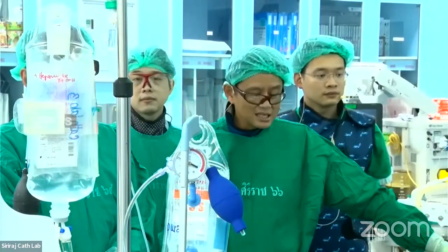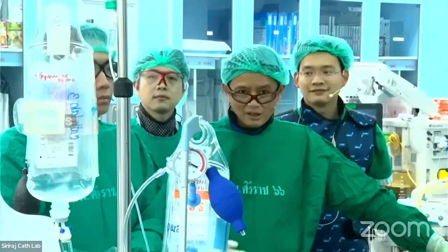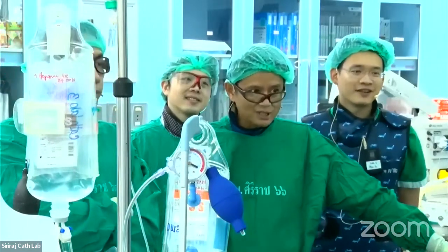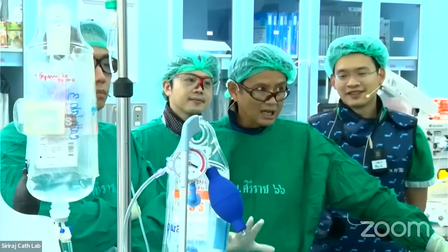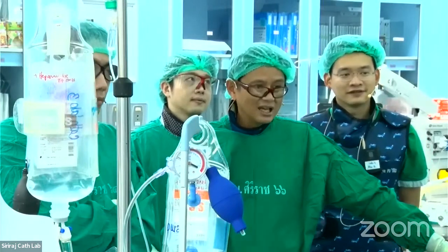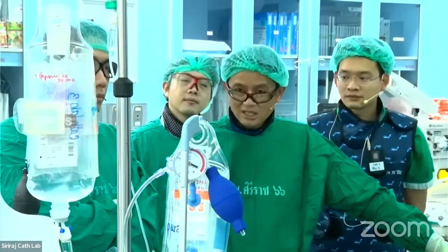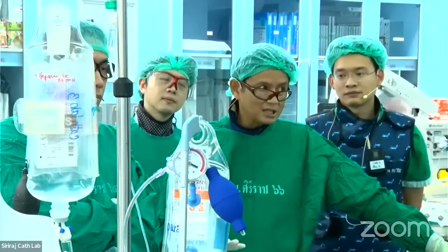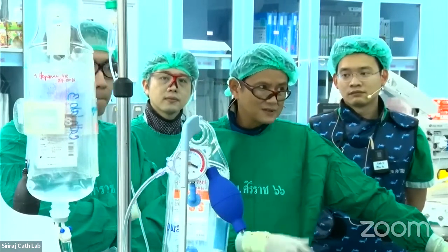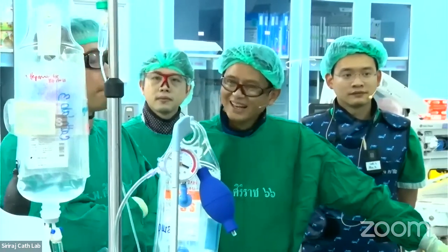And then decision, kiss, not kiss, I think it could be routinely, I kiss all the time. But on this case, if I kiss and I dissect, I may end up with two stents, which I didn't plan at the beginning. So I'm leaving the kissing balloon at the ostium, not to do it. And then we do the case based on intravascular imaging, and then we do post-intravascular imaging to see how optimal the outcome is. And then we can integrate the physiology in the ostial circumflex. So I think that's all the learning points.